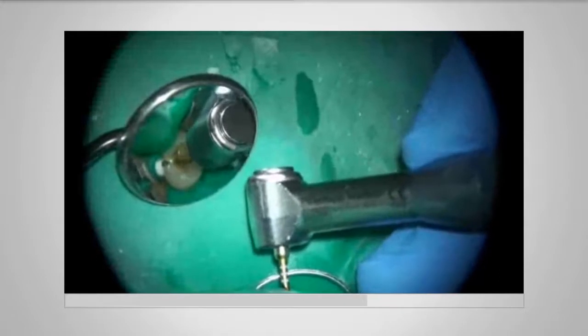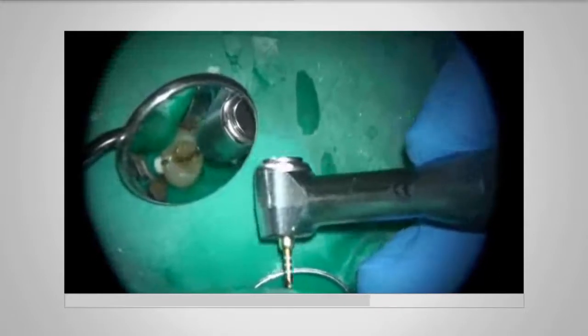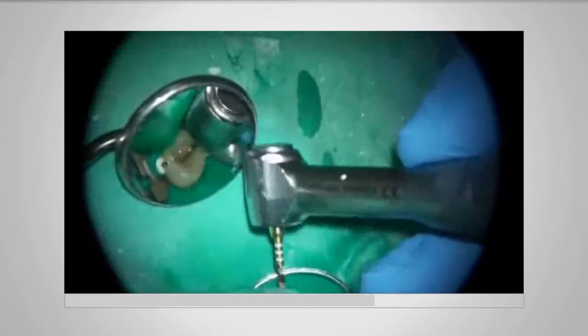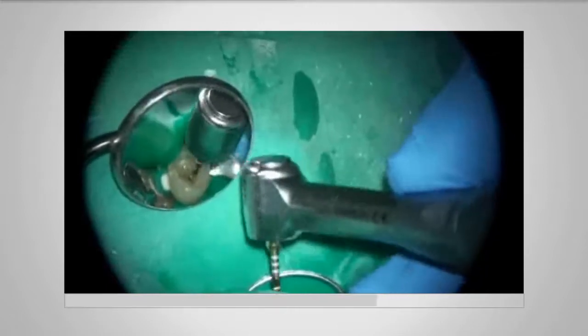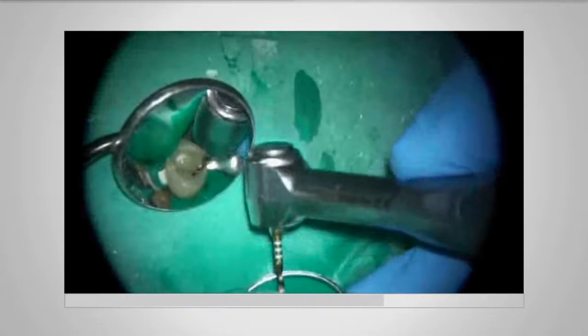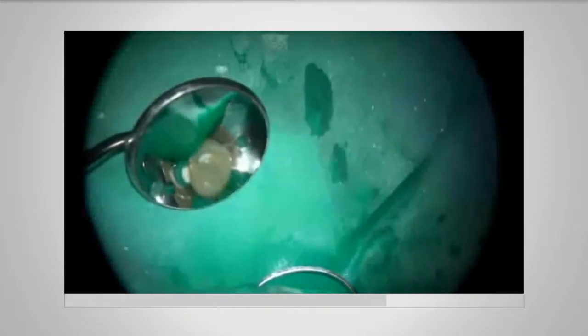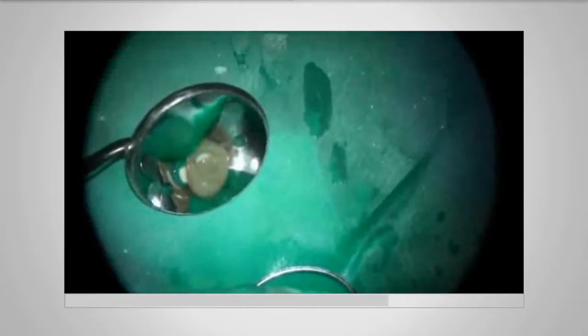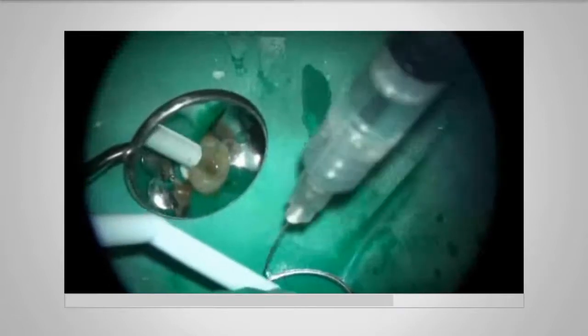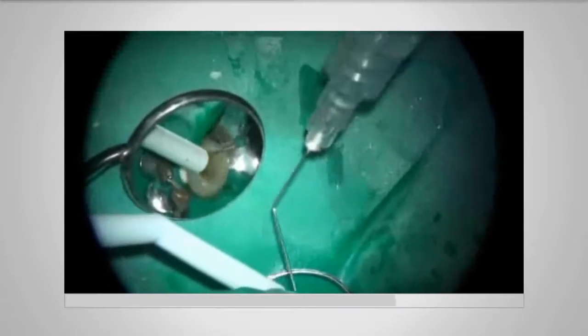I am using a small instrument first to create a tapered glide path, and then I'll finish the preparation on a primary instrument. So use more irrigant, recapitulate, check for patency, and then back in with the reciprocating instrument.